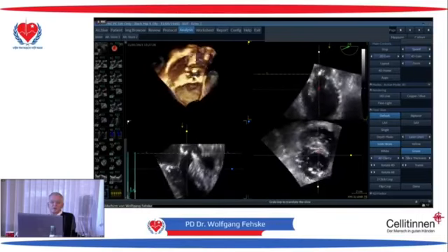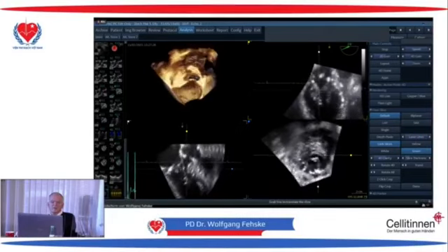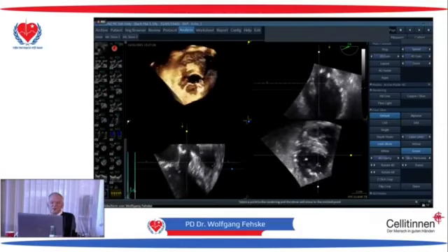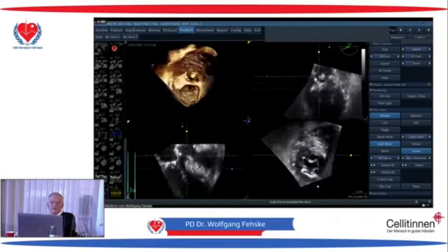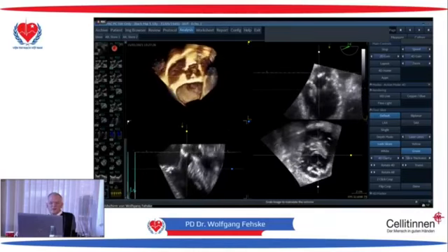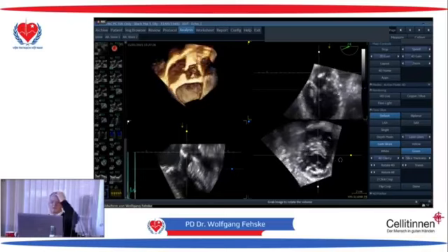You can go through it, but the subaortic area here is very, very small. This is smaller than what you will put in as a prosthesis, and you also risk immobilizing the anterior leaflet, and this will give mitral stenosis.